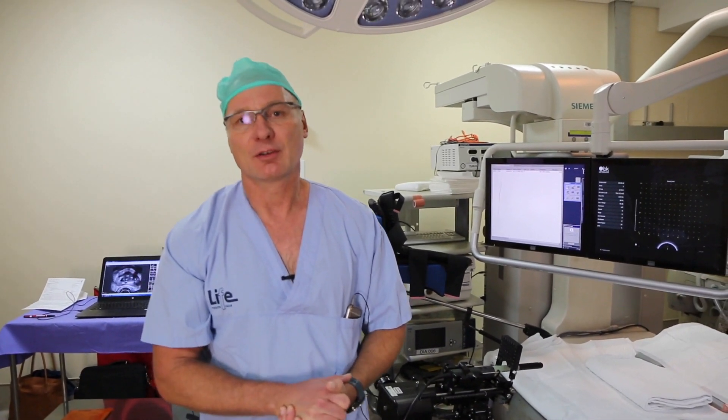We are in the theatre this morning, basically just with a setup of brachytherapy that we use for prostate cancer. We can go into the detail of what we use brachytherapy for, but it is for localised disease that we need to treat the prostate.